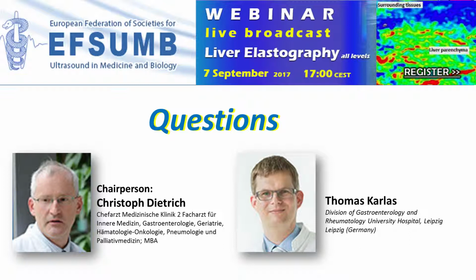Yeah. So ascites is a problem. Patients with ascites have been excluded from most trials, so the knowledge is limited, and it increases measurement depth, and thus the precision will be lower. But of course, patients with ascites will have advanced liver disease and will have normally measurements above the cutoff value of cirrhosis.